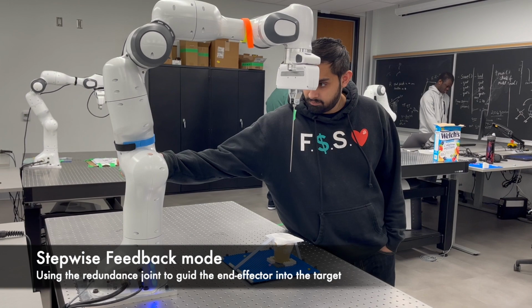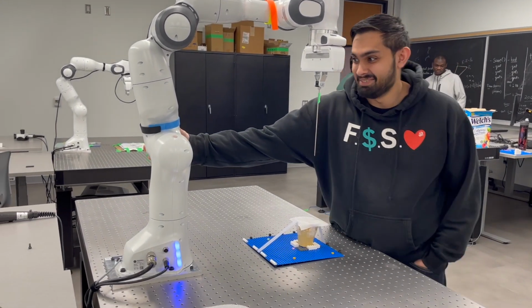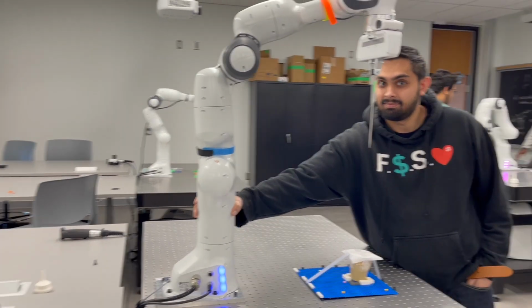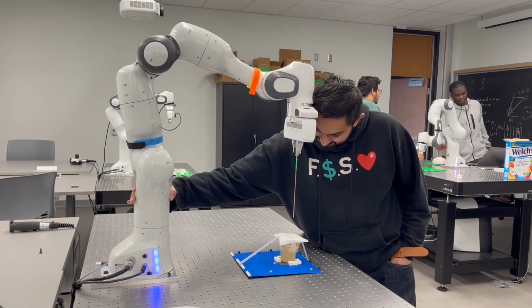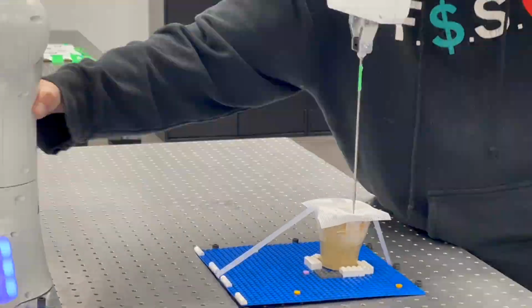Starting with the stepwise feedback mode, first we have to give the program the voxel space of the target we're trying to reach for a biopsy. This can be identified by an X-ray or an MRI machine. Then we can use the redundant joint at the base to move the robot in and out of the organ. To realize the full potential of our program, let us first look at the impedance biopsy mode.